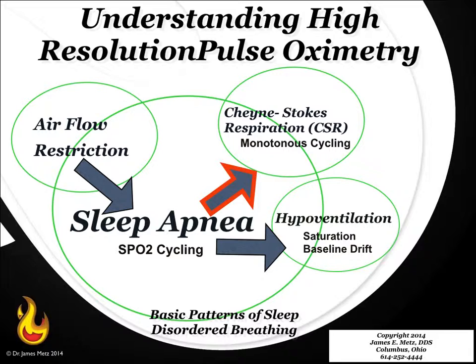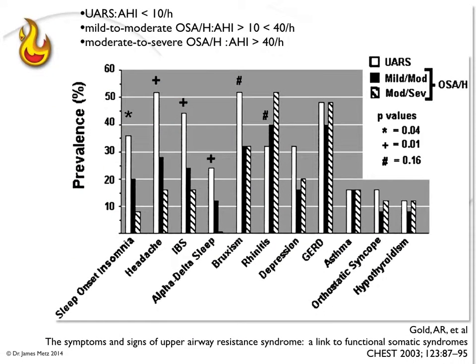So what we're doing is we're going back to this airflow restriction, the sleep apnea, and the Cheyne-Stokes, and hypoventilation. What we're trying to do is reverse all these. We're trying to take it back to airflow and then make it go away.